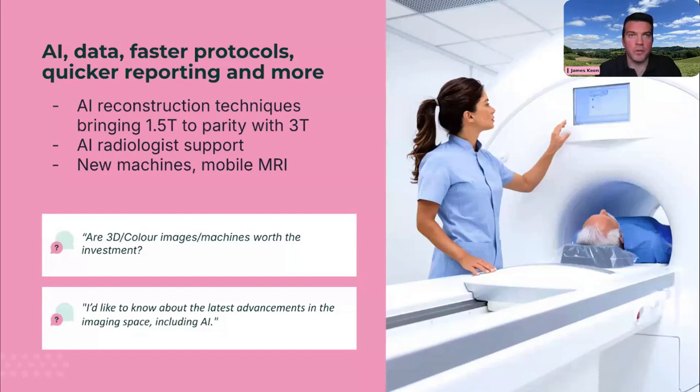But each of those brain packages perhaps has half a dozen different algorithms looking for traumatic brain injury, multiple sclerosis plaques, brain aging and dementia, and signs of stroke. Each of those comes with a fee, and none of them replace the radiologist.